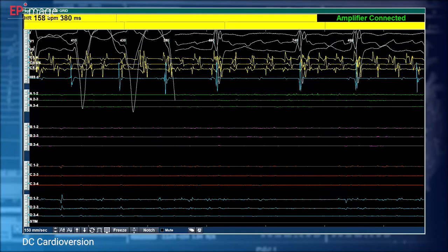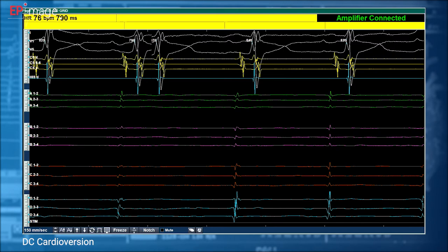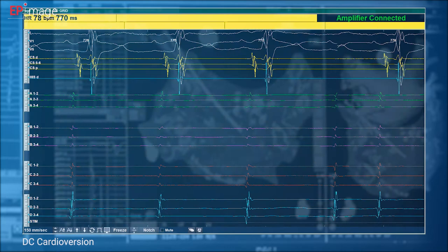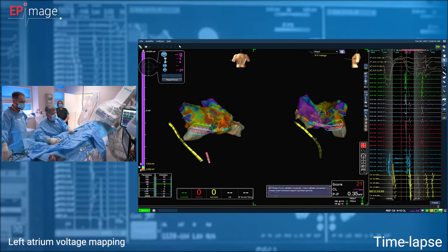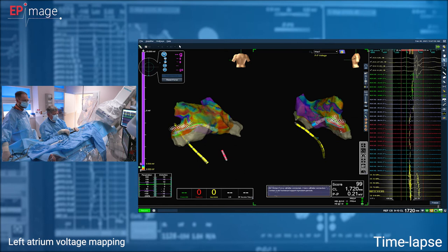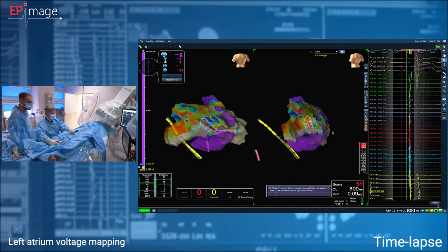We perform successful cardioversion, so we now have sinus rhythm in the patient, which will allow us to perform reliable voltage mapping. And that's what we are starting now. It's recorded with some kind of accelerated rate, just to shorten the process of mapping for you.